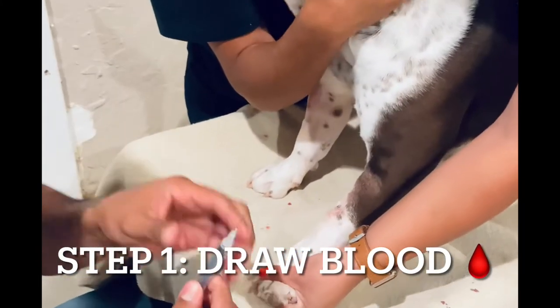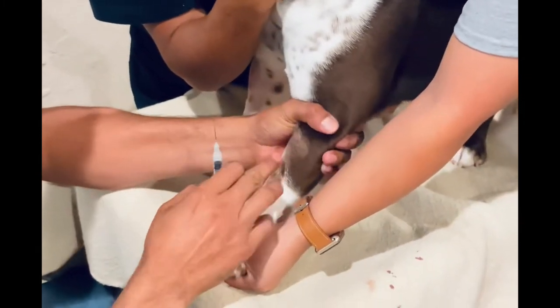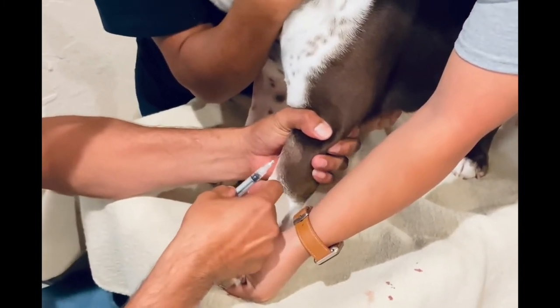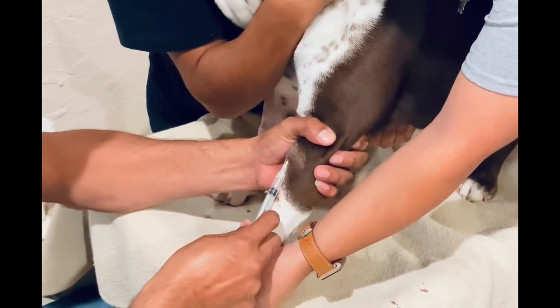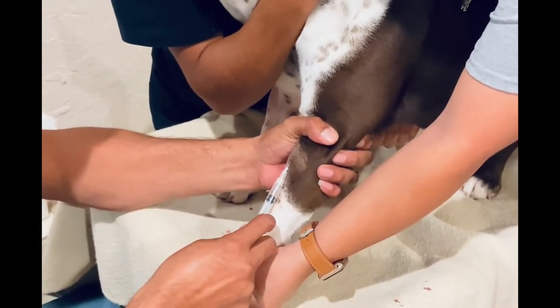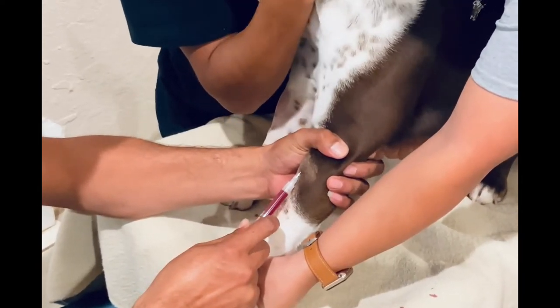When drawing blood, you want to apply pressure on the paw and stretch the leg. Feel for the vein and insert the needle. Once you see a little bit of blood in the needle, you know you're in the right place, and just proceed to draw two to three cc's — it's perfectly fine for this test.